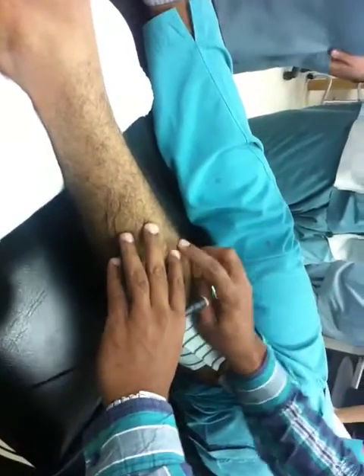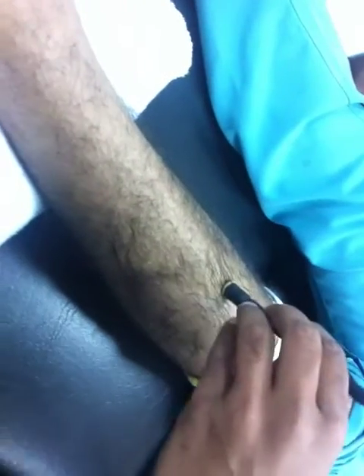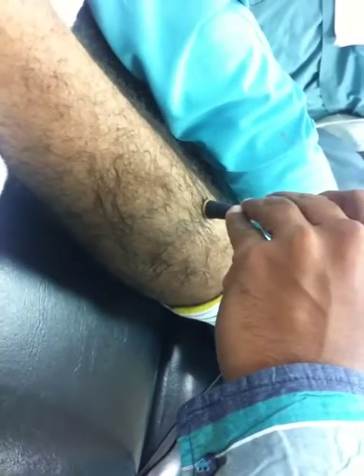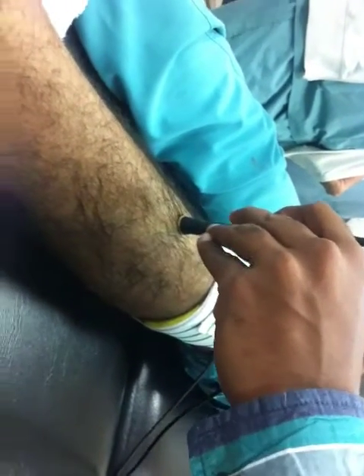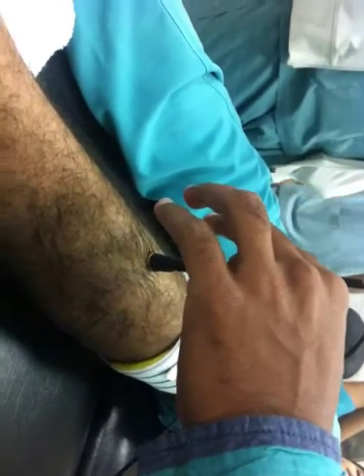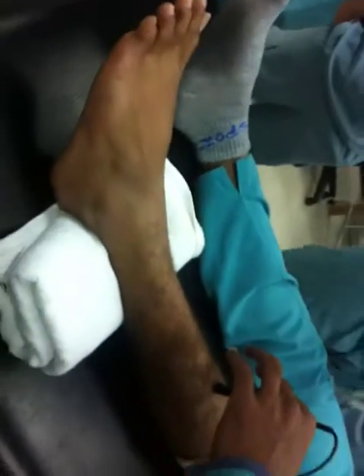So you palpate for the shin — this is the anterior border of the tibia, just lateral is the tibialis anterior. I palpate for the tendon here. You can go with a semi-Fowler's position with a bed and elevator so that the patient can see the movement — this is a kind of visual feedback for them. This is the motor point for tibialis anterior.